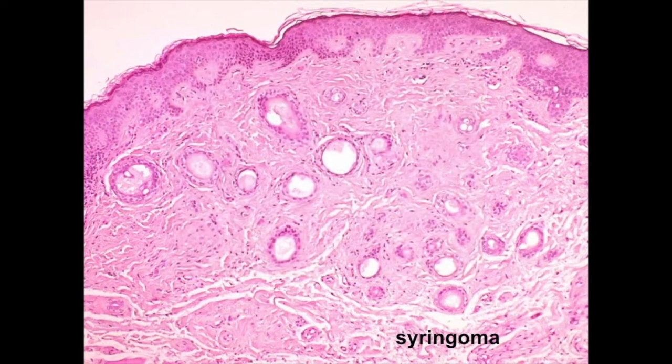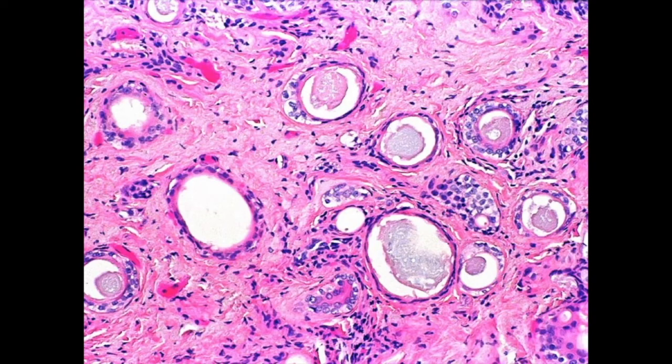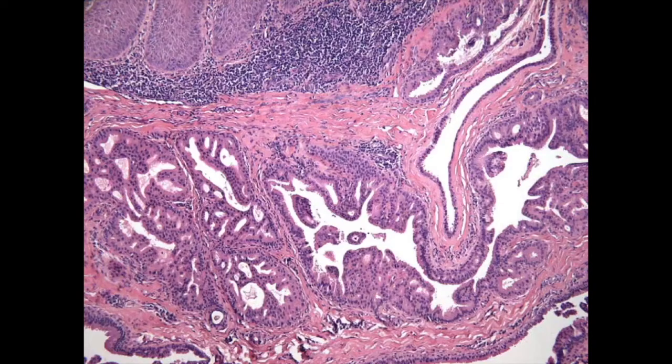Histopathologically, we see these round or comma-shaped formations composed of benign eccrine sweat ductal cells. Here's another example of a syringoma. Another rare sweat gland tumor is the syringocystadenoma papilliferum. This has a squamous component on the surface, and then the cystadenoma component deeper that typically has lots of plasma cells invading this stroma.